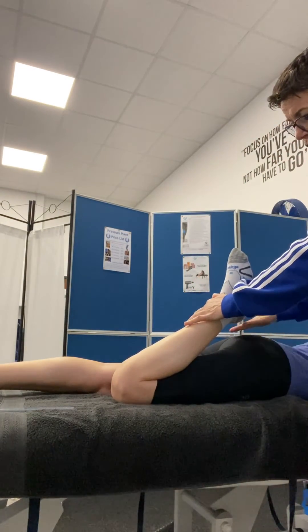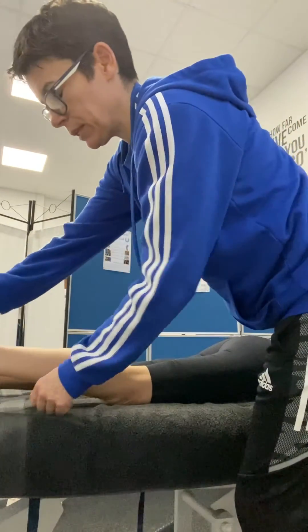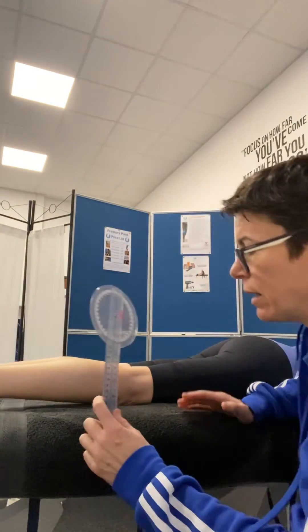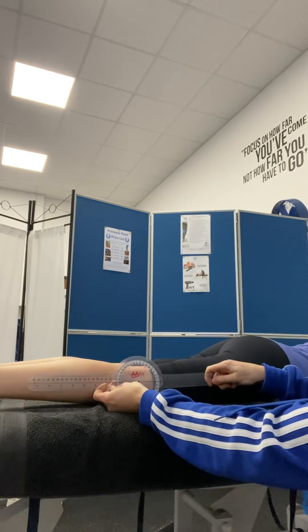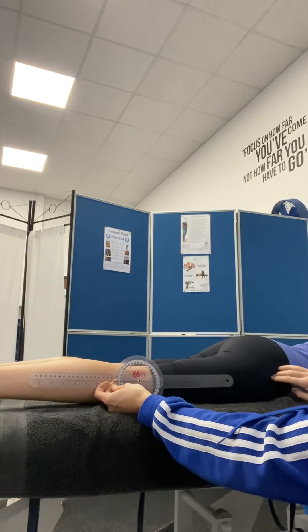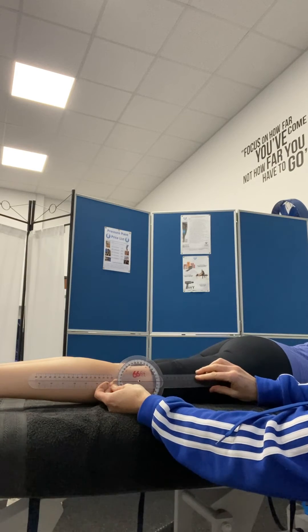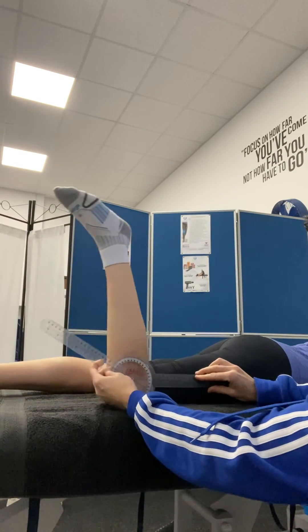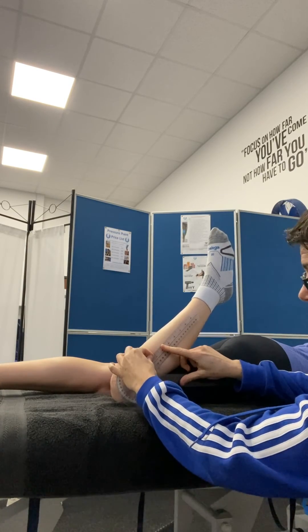Again, you could just measure between heel and bottom in centimetres. But with a goniometer to get a degree measurement, I want the centre of the goniometer at the lateral knee joint line, same as before. One arm goes down to the lateral malleolus, the other arm goes up to the greater trochanter. As the client goes to flexion, you track that arm down to the lateral malleolus, like so.